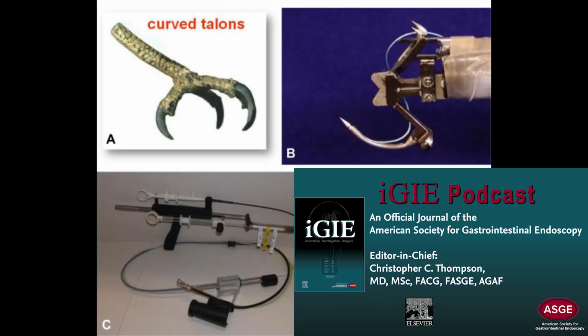Yeah, I will. It is a long road and a lot of just incredible innovation that went into it over many years. The original designs go back to the group I mentioned and Dr. Sidney Chung. The very first version of Overstitch was called the Eagle Claw. It was the concept of an eagle's claw that got the curved needle that now is integral to the Overstitch device, for those who are familiar with it. They worked with Olympus, who funded their research for many years. And it was, again, just a group of physicians doing primary research.